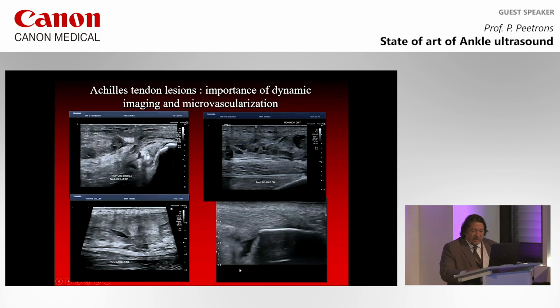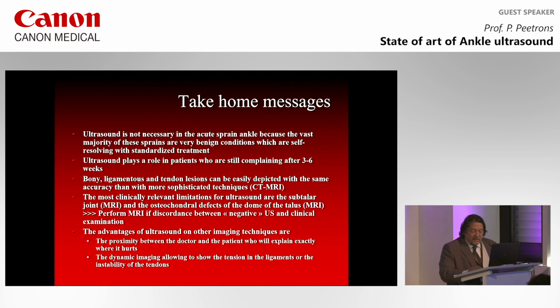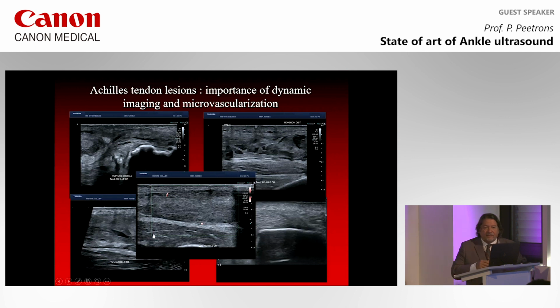And the last picture that I will show you is the picture of the microvascularization. Microvascularization is very important when you have tendinopathy to tell you if the tendinopathy is active or not. But don't forget that the position of the foot is very important. If you do microvascular imaging with the ankle in tension, you will not see any vessels inside the tendon. And when you are looking at the Achilles tendon, normally you ask the patient to do a little bit of dorsal flexion of the foot to stretch the tendon.